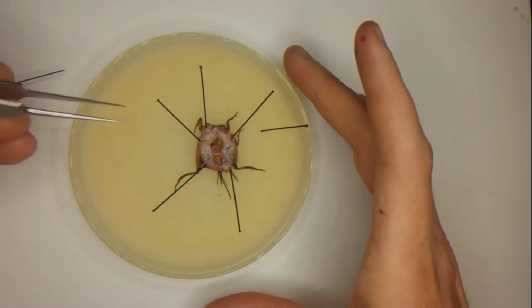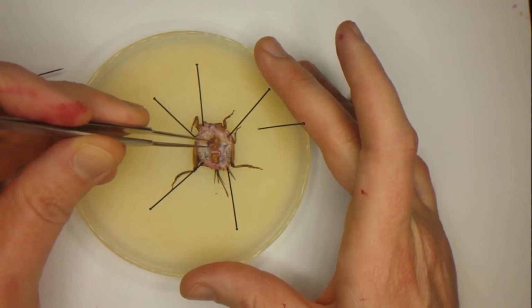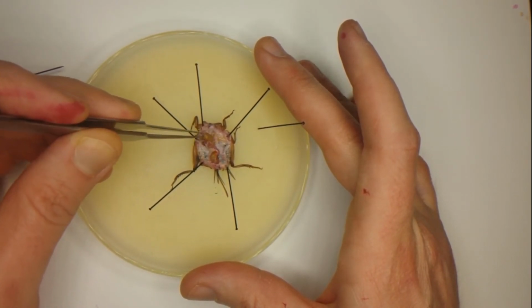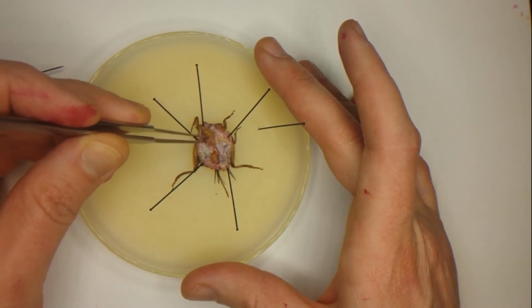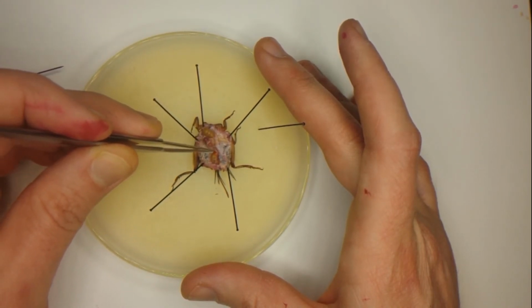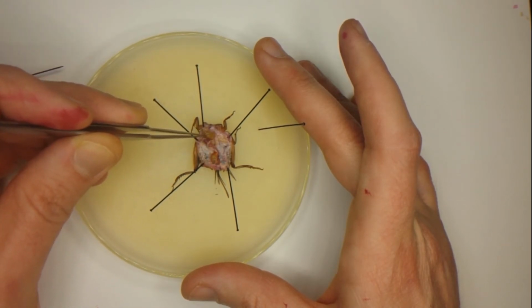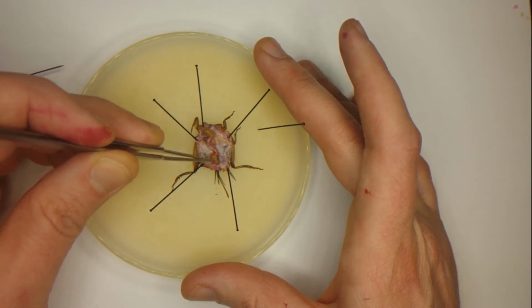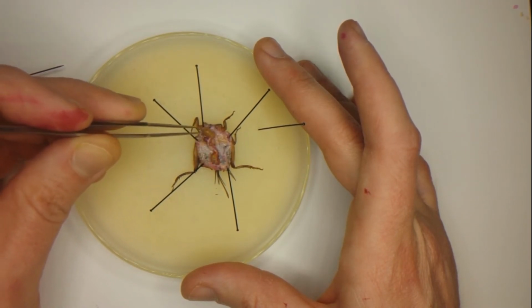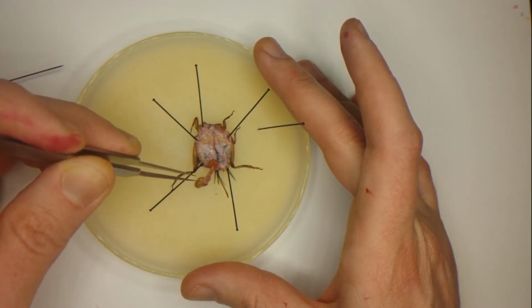Alright, so now we're going to take a little tour of this cricket's digestive system and other internal organs. So I repositioned her a little bit. This right here is the cricket's crop. You can think of that as being like its stomach. And the whole digestive tract is going to be connected together continuously. So if I actually pull that up, I'll bring everything with it. And the Malpighian tubules here are associated with the hindgut. But I'm just going to move those out of the way for the moment and point out a couple other things.